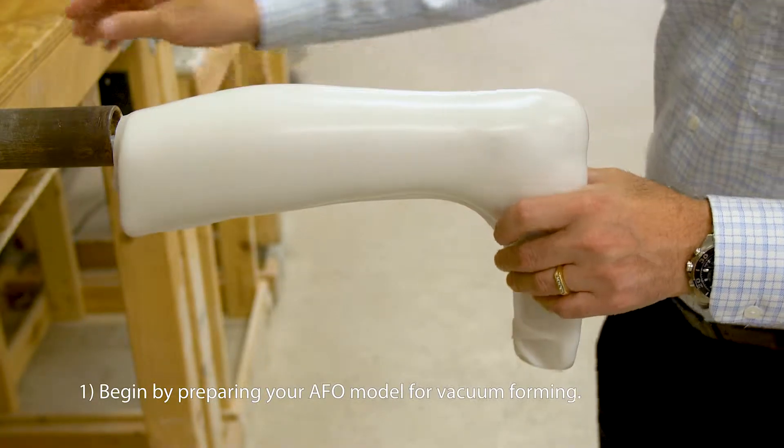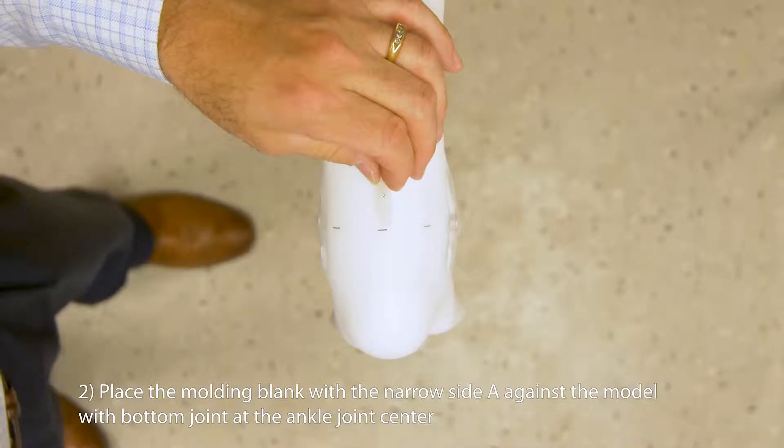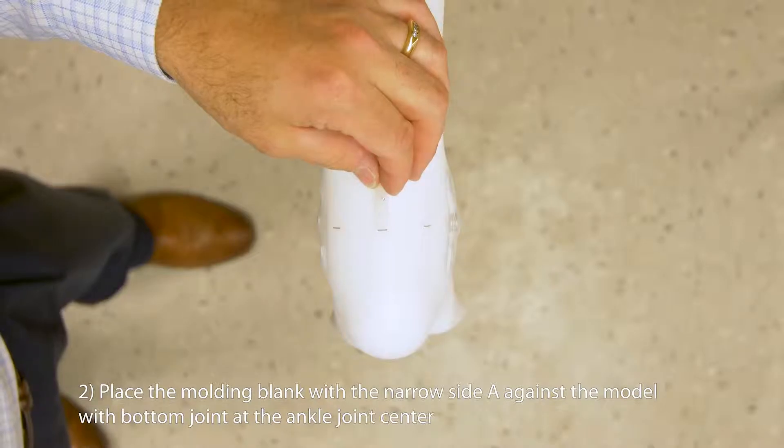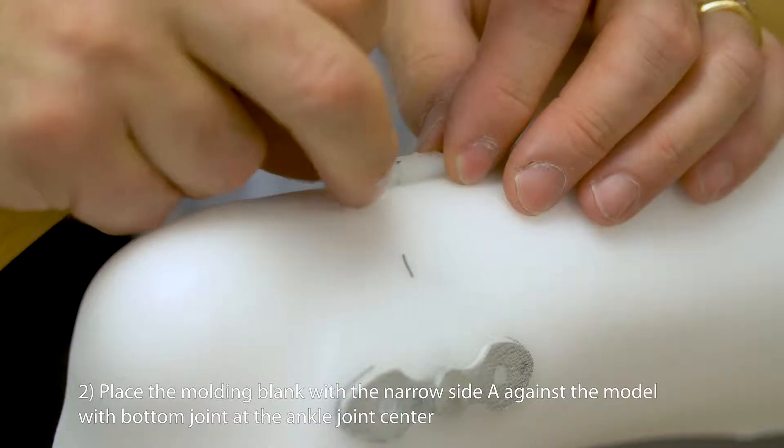Begin by preparing your AFO model for vacuum forming. Place the molding blank with the narrow side, A, against the model with the bottom edge at ankle joint center.